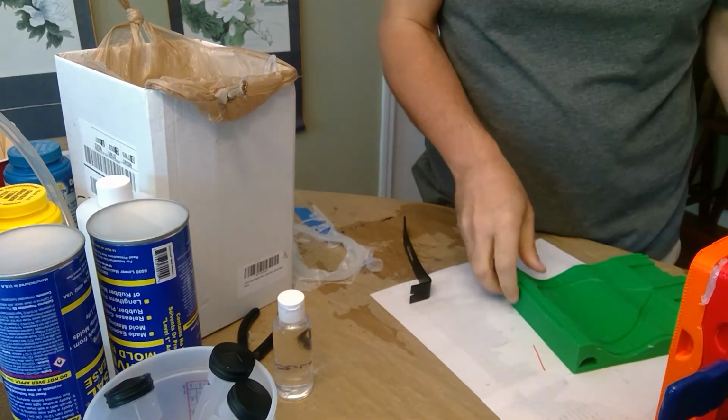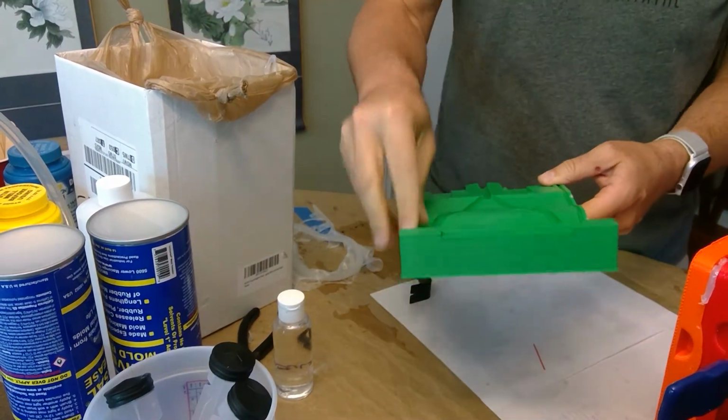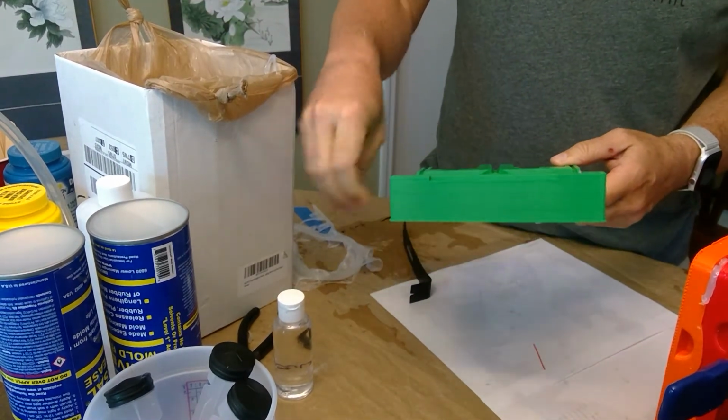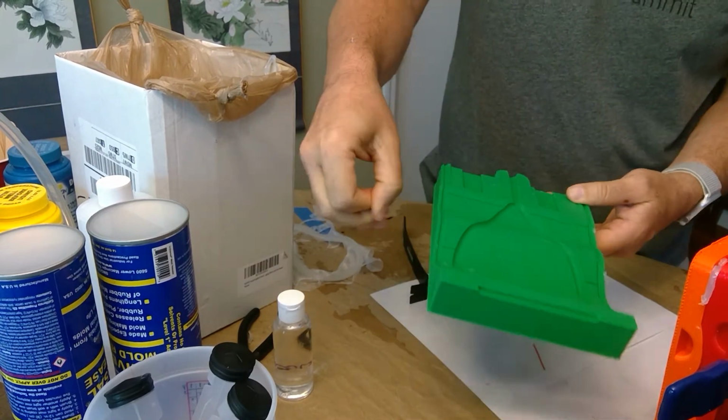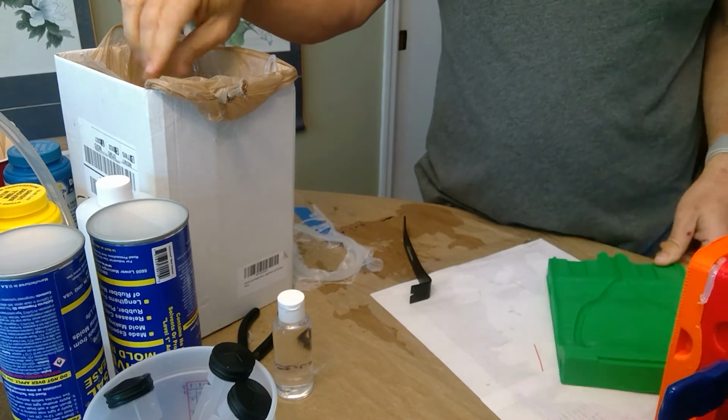There we go for that. This one is pretty clean. There's two or three little spots. Get those out, and we're good to go.